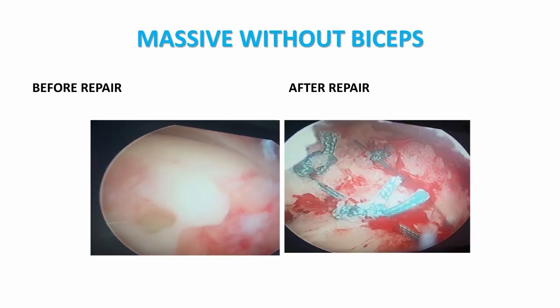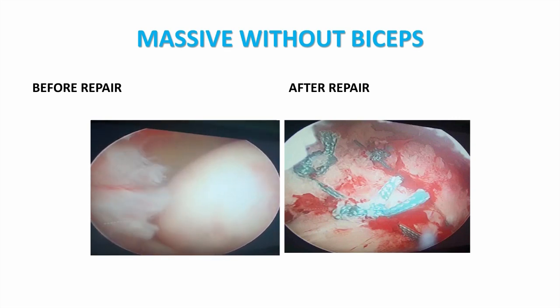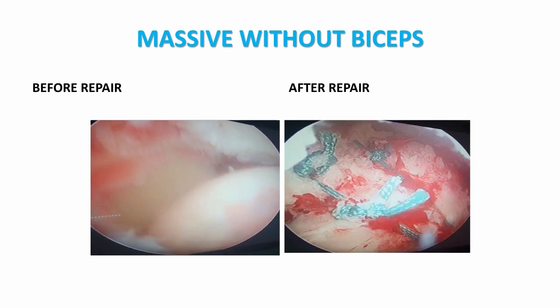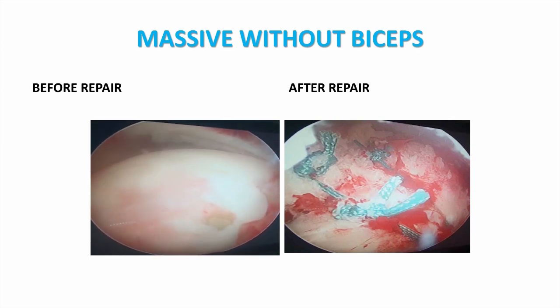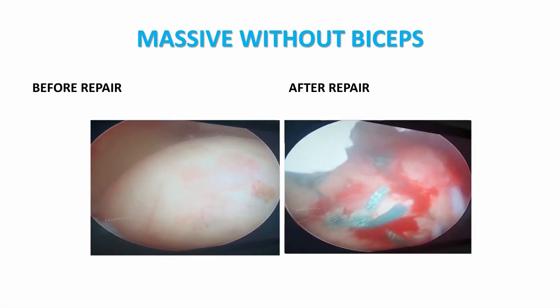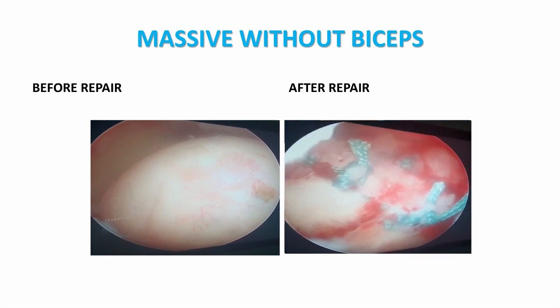Here's another case with a massive rotator cuff tear without a biceps tendon before reconstruction of the repair. And we see how the infraspinatus is also completely torn, the supraspinatus, and part of the subscapularis. There's no biceps. And here, after reconstruction, of course, mobilization here is very important. It took a long time to get the mobilization of the remainder.